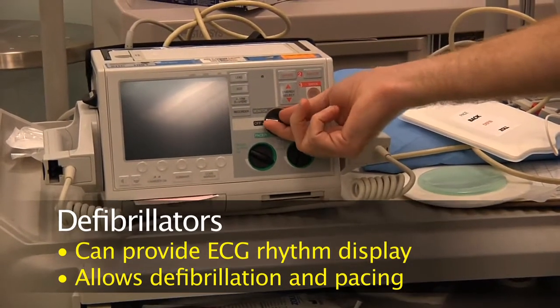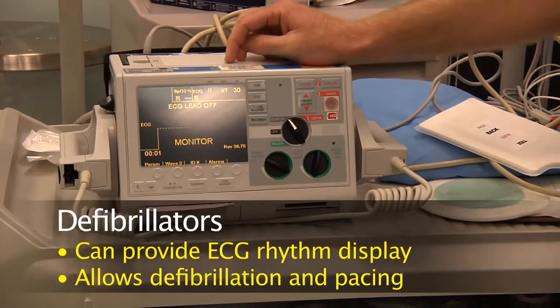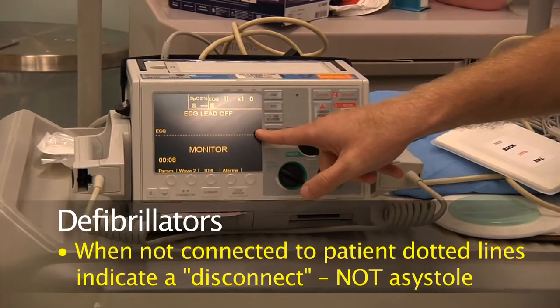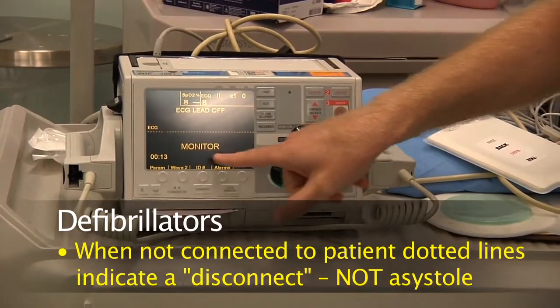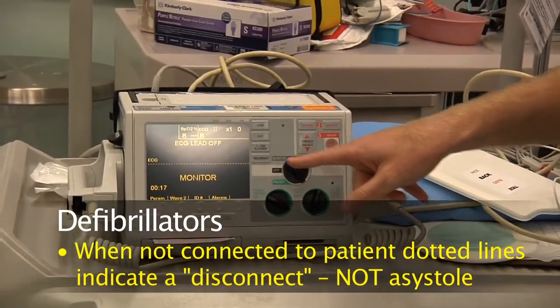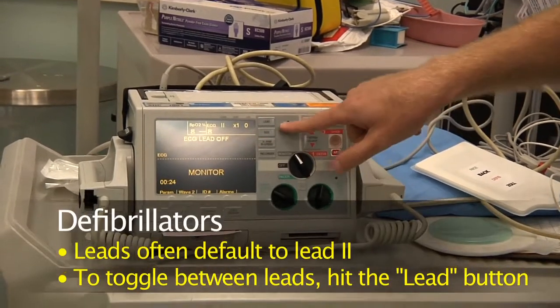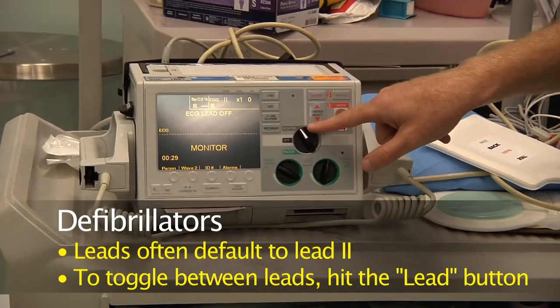So first thing I'm going to do is turn it on to monitor, and it takes a second to fire up. Important thing to note: almost all defibrillators, when they're not connected, give you dotted lines for disconnect. That is not the same as asystole. Asystole is a solid line. A disconnect is a dotted line. That's very common. Other things to know is that the leads often default to lead 2. So this defaults to lead 2. If you want to change your lead, all you have to do is hit the lead button, and you can toggle between the different leads.